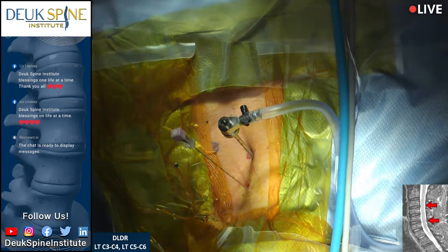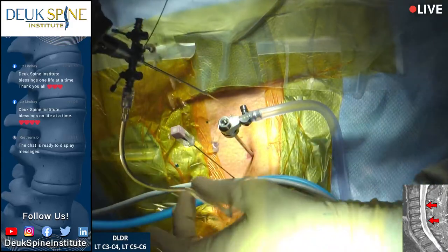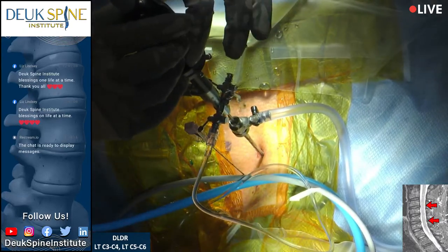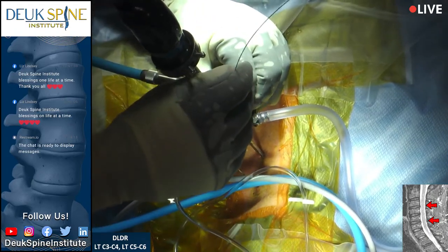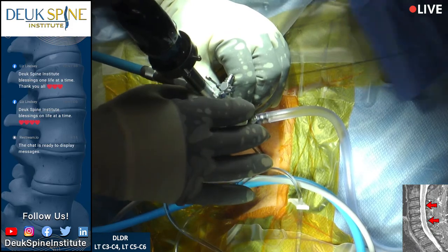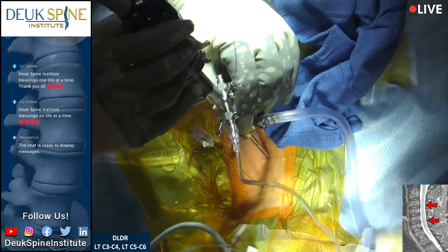You can't see any of that pressure on the MRI — that's why MRIs are not entirely trustworthy. While you're watching, feel free to ask questions. I'm going to have Henry play one of our videos showing why annular tears with herniations cause neck pain and how they cause arm pain — the answer is inflammation. Traumatic injury on the disc can cause annular tears to form.